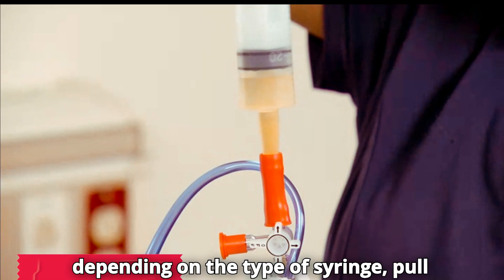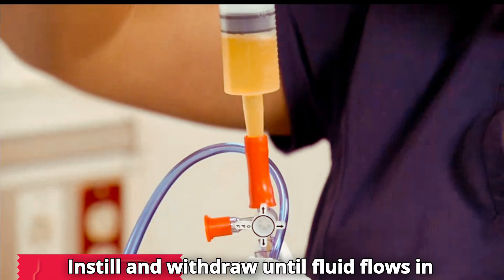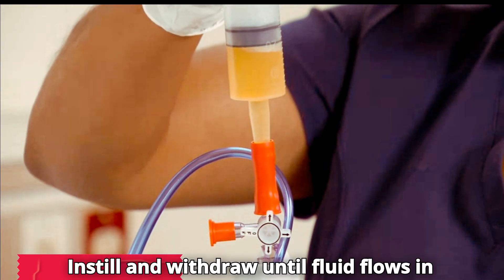Or, depending on the type of syringe, pull back the plunger to withdraw fluid. Instill and withdraw until fluid flows in and out freely.